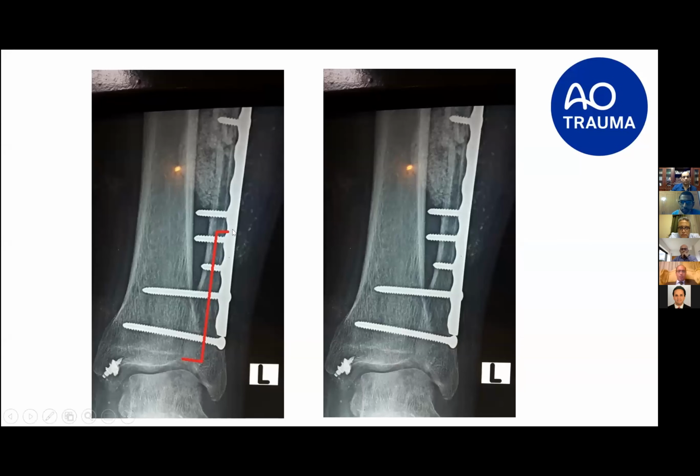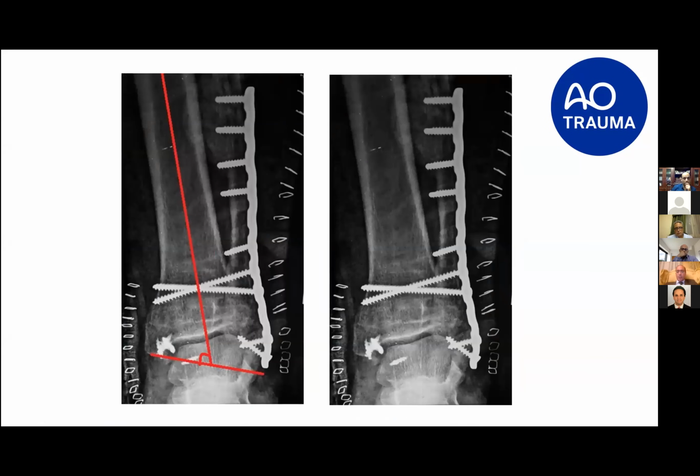Very long scarf osteotomy, lateral limb here, and then longitudinal cut, and then a medial cut at the level of the joint. So I left this area alone with the bony union, and then I moved the fibula down and fixed it. And here is the post-operative X-ray, and you can see the change of the intermalleolar line. The intermalleolar line angle is now about 80, so the normal is between 75 and 85. It was 90 in the beginning.